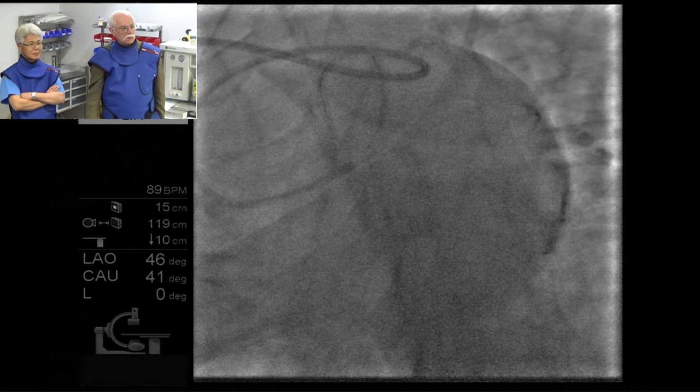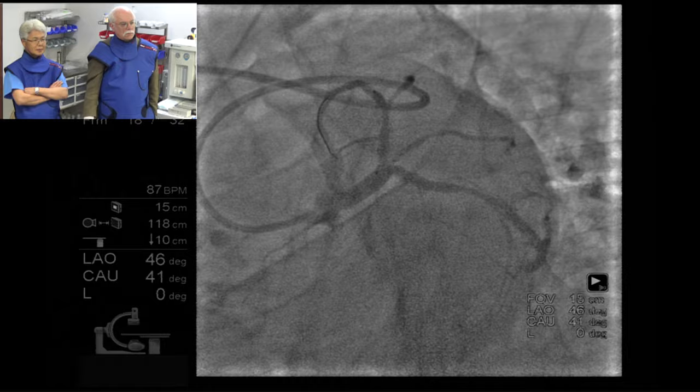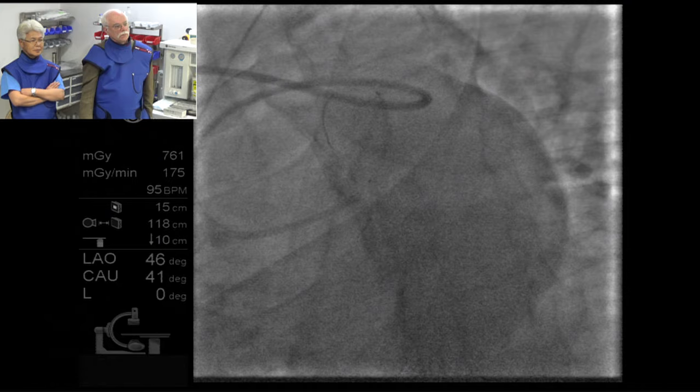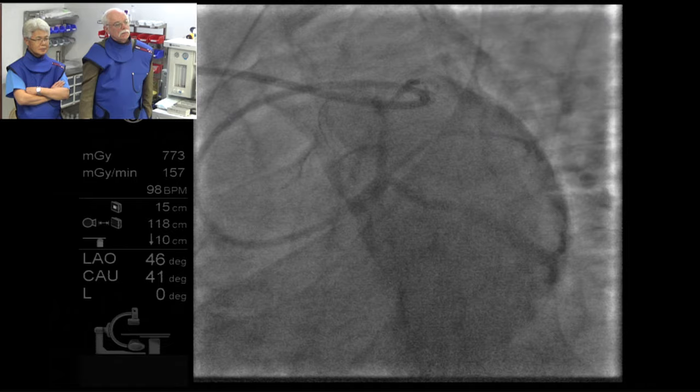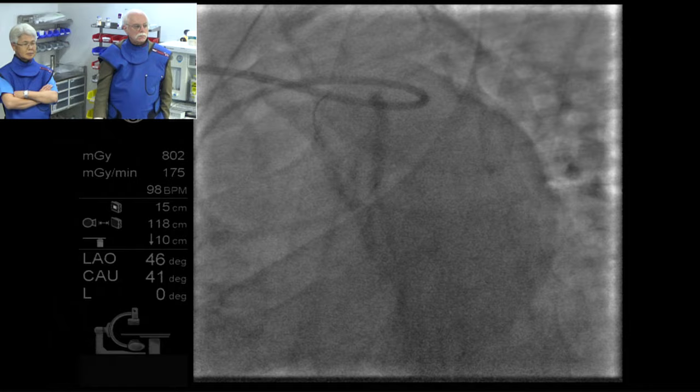Is that okay? Looks good. I think go up. There is a chance that we may compromise the diagonal. We will see. We'll fix it, if at all. Mostly not. I think it'll stay open. I think everything will work out here. It's a good location, good length. Quick. Oh, it has come out. Go. 12. Keep it for some time.